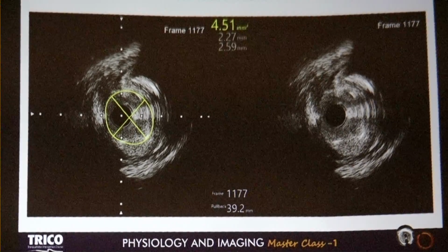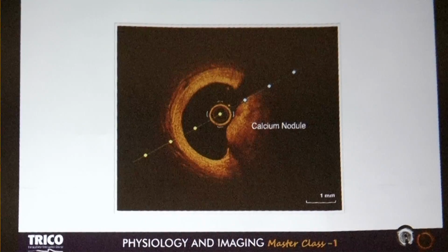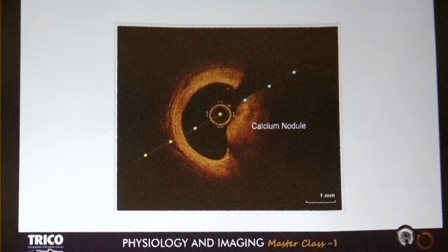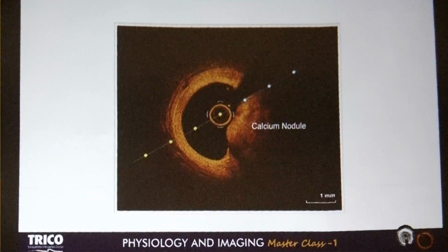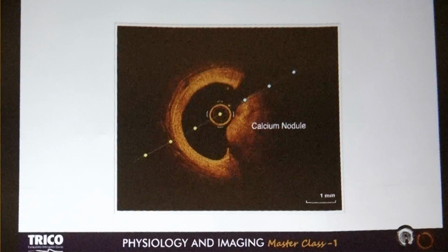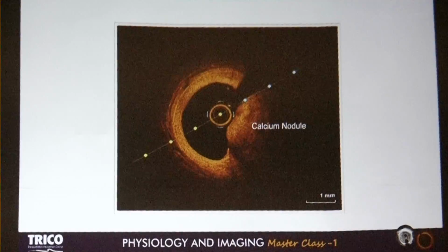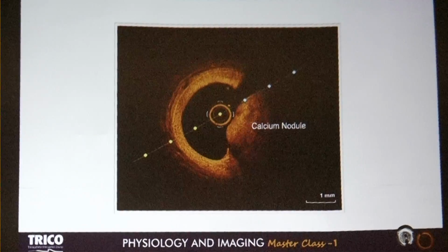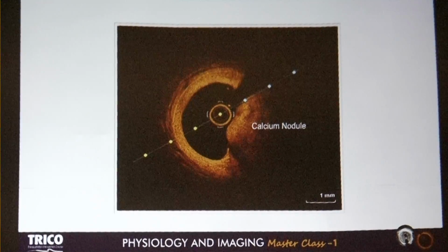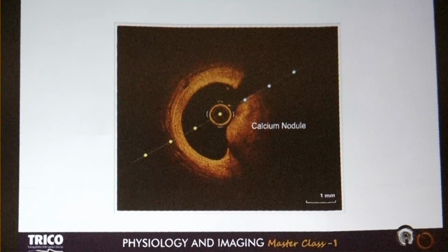I accepted it, because when I analyzed retrospectively, I had missed this nodule at that point of time, hurriedly interpreting the OCT image. Had I interpreted it well, spending a good 1 or 2 minutes on interpretation, I would have eliminated the nodule and stented the distal area, because the side area is perfectly all right. It is a healthy segment, and there is a nodule, and it is an extremely stable area with a 4.5 lumen. I would have been fine.